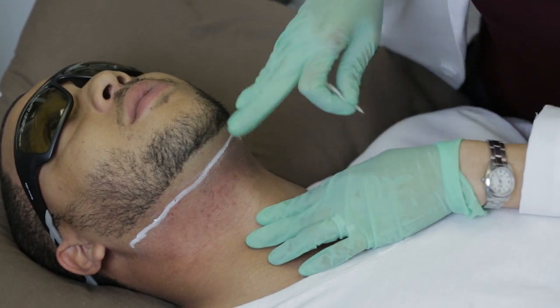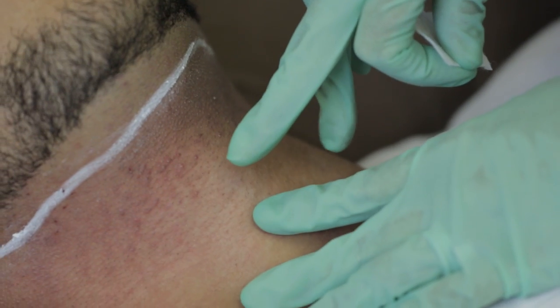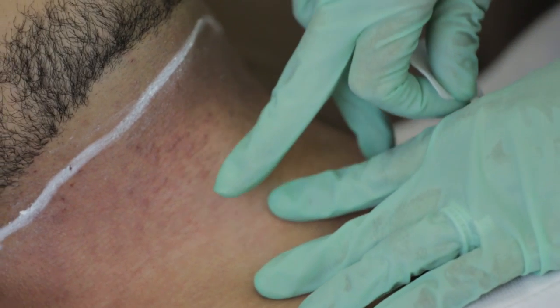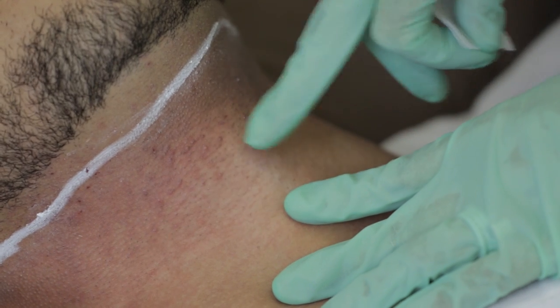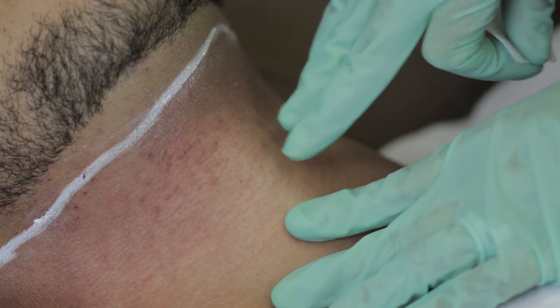The clinical endpoint to look for with laser hair removal is a little bit of erythema, which we see here, as well as some perifollicular edema, which is just a little bit of swelling directly around the hair follicles. That's very normal and actually shows a great result.